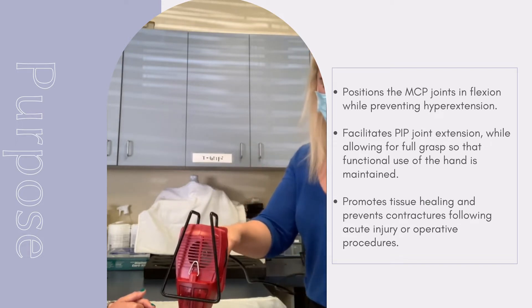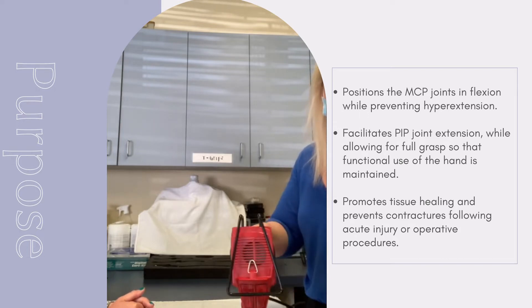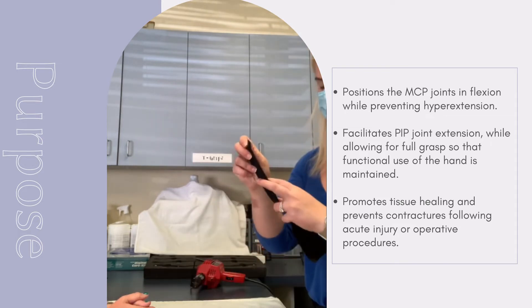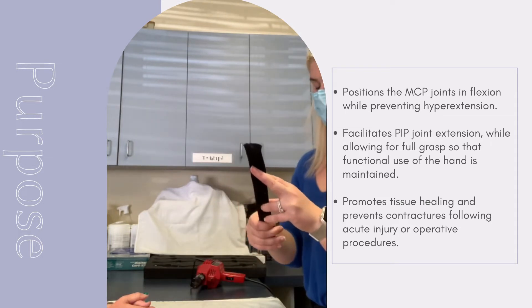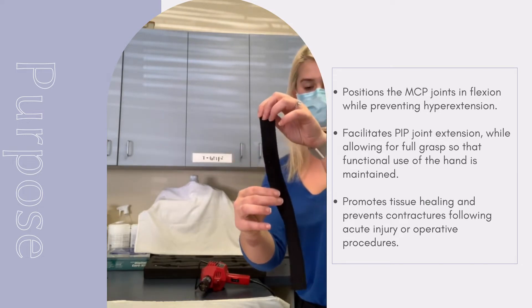The longer that we apply the heat, the more working time that we'll have with the material. Once the material is heated, we fold it in half lengthwise and pinch it together so that it adheres to itself. As a result, the material is a little bit thinner, but also provides enough support to prevent hyperextension of the MCP joint.